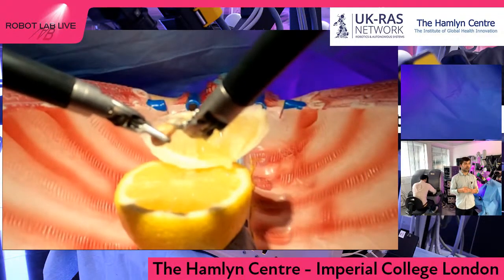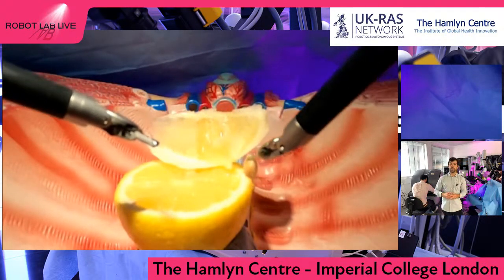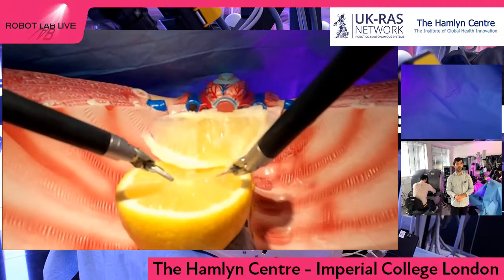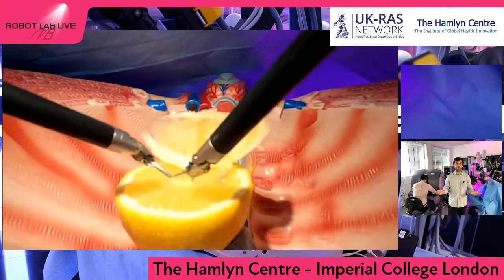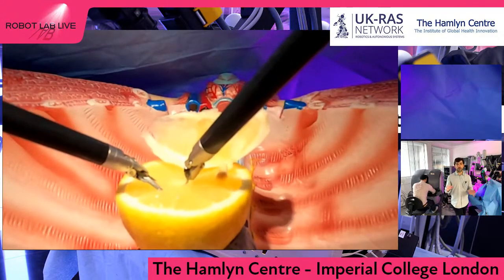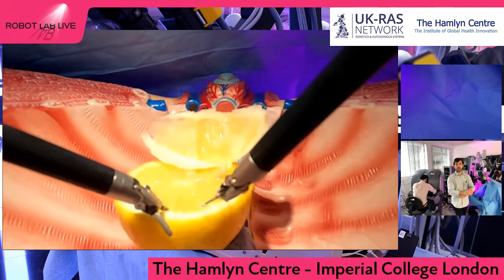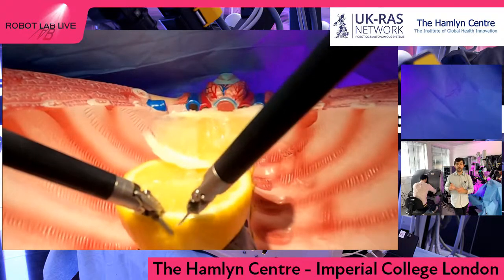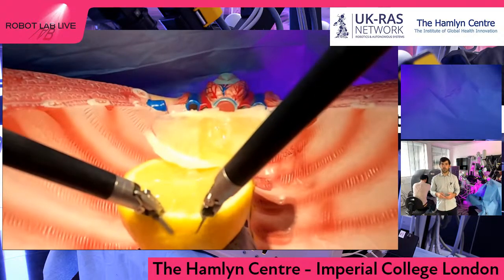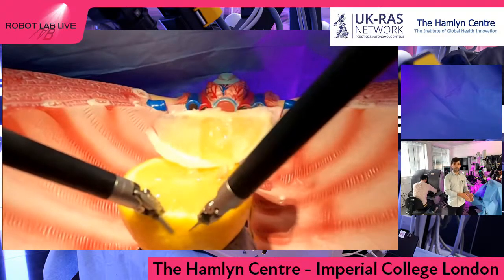But if we put our mind a bit forward, right? Like how the future of surgical robotics would look like, and we would think of an autonomous procedure, right, in which the surgeon is still in the picture, supervising, but the robot is able to do everything on its own. But before we do that, we have to teach the robot how to do these things.